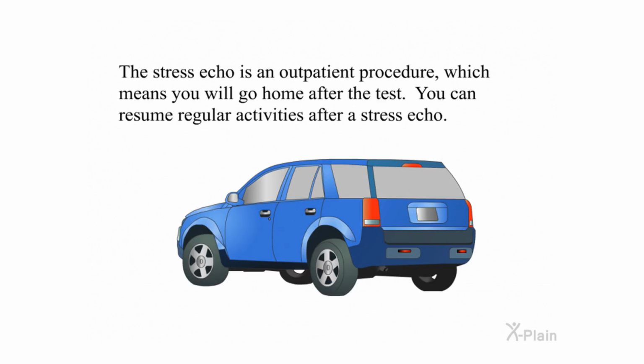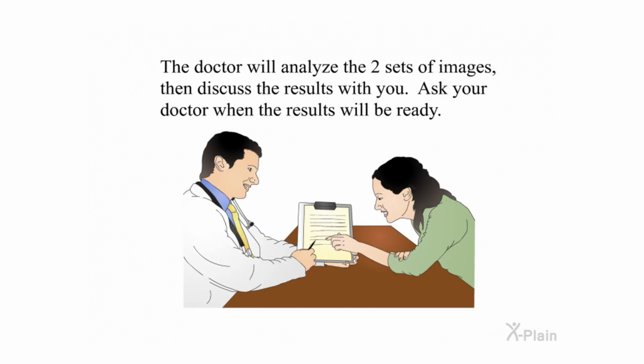After an echo. The stress echo is an outpatient procedure, which means you will go home after the test. You can resume regular activities after a stress echo. The doctor will analyze the 2 sets of images, then discuss the results with you. Ask your doctor when the results will be ready.